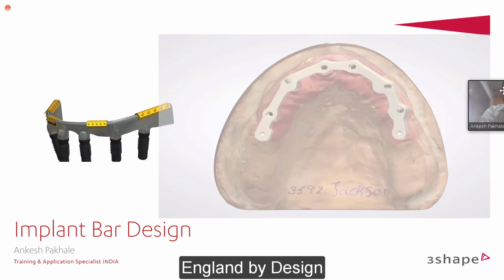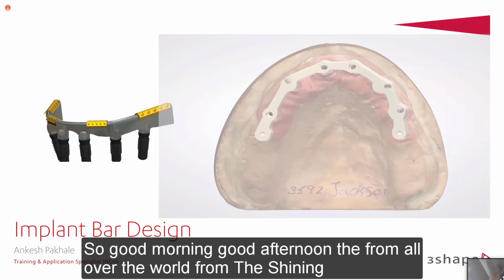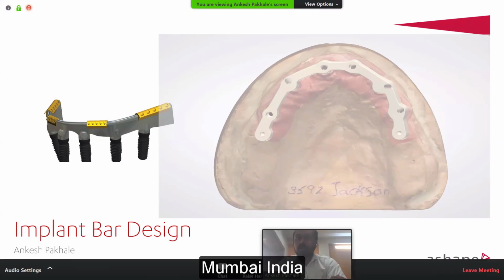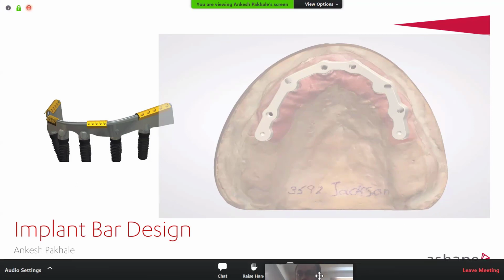So, okay, let's start with the implant bar design, which we are going to take a look at in the 3Shape software. Good morning, good afternoon from all over the world, from wherever you have joined in. Myself, Ankesh, I'm from Mumbai, India. So here I'm going to present to you. It's almost afternoon over here, 2 p.m., and I'm doing it from my home since we are all locked down and compulsorily seated at home.